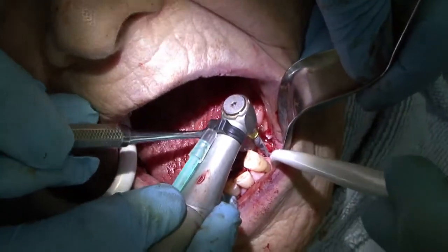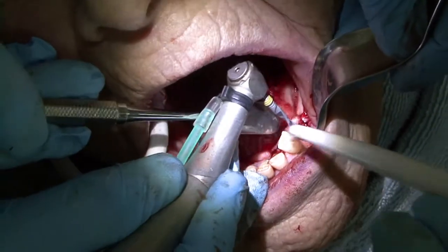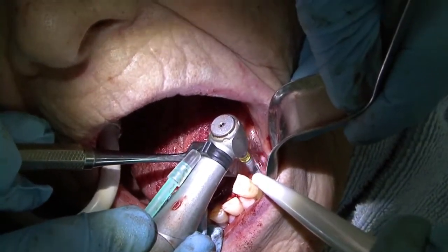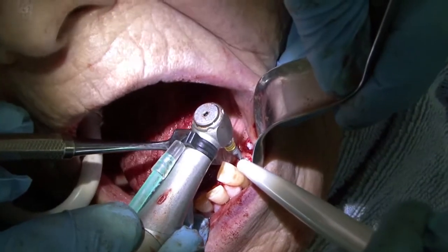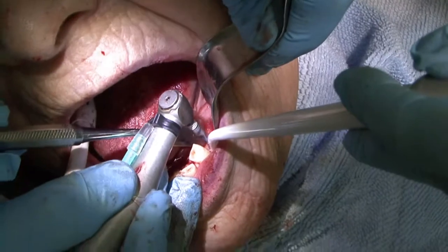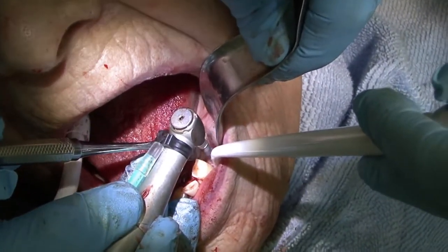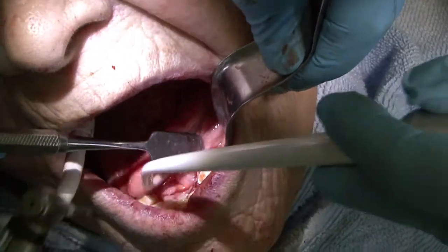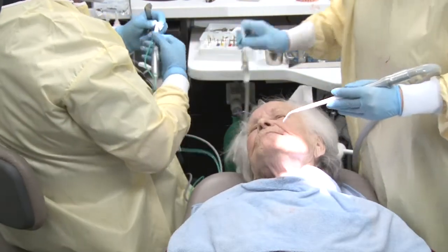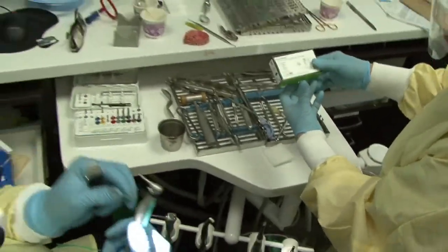I have to see if I'm down all the way. I think we're okay. Let's go to the next one. Let's go ahead and switch to the number 4x12. You say 4x12? 4.0, yeah. Okay, that's good.